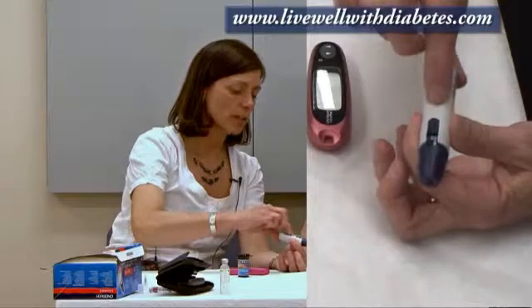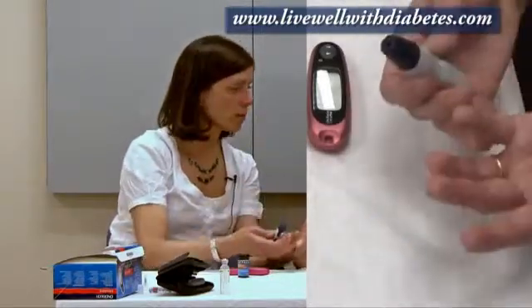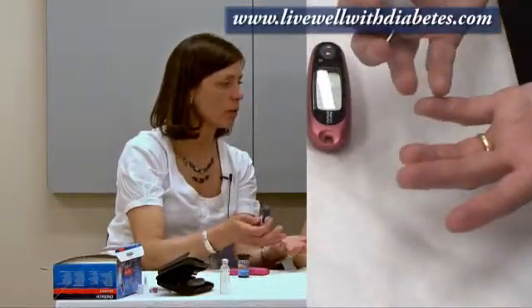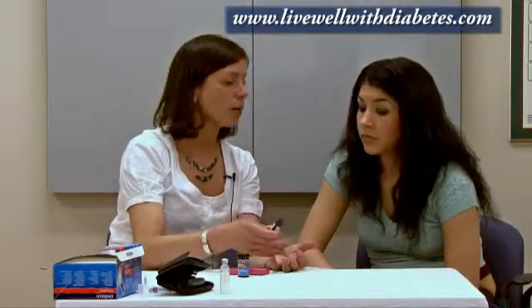First, get this ready. Then make sure your hands are clean — just wash them under the tap with soap and water. I don't need to use an alcohol wipe on my fingertips because the alcohol will just dry my skin out, make it tougher, and start to crack, which is not comfortable. Washing alone makes my hands clean and also warms up my fingertips, so I'm more likely to get an adequate sample of blood on the first try.